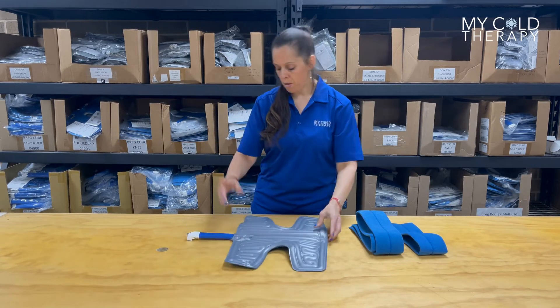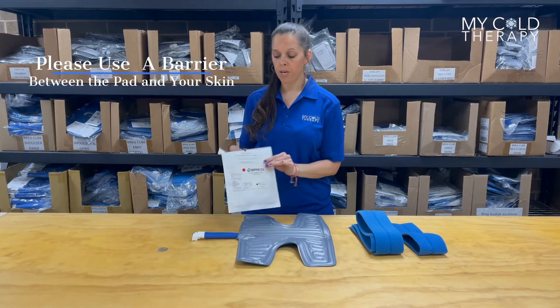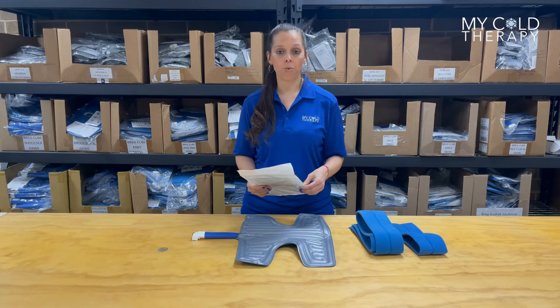As always, make sure you have some type of barrier between the pad and your skin. We do sell the sterile dressings that you can use — they stick right on the pad — but you can use any type of barrier you want to.